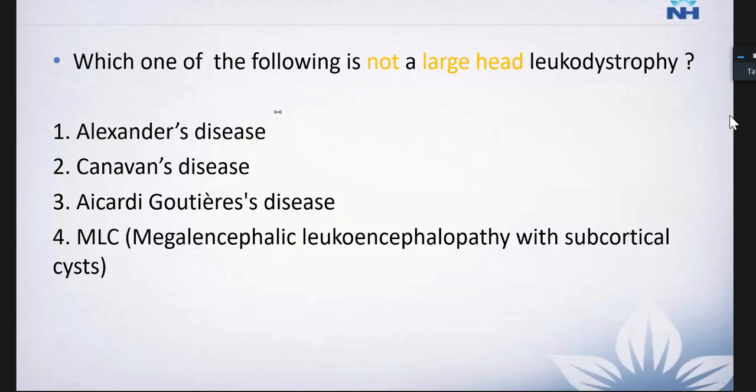Now, another question is whether you should use single voxel or multi-voxel. Single voxel is usually used when the pathology is very focally defined. In those scenarios, you should use single voxel, for example, a tumor or a lesion very close to the CSF or close to the bone, where you are expected to have a lot of artifacts. So in those scenarios, we use single voxel.